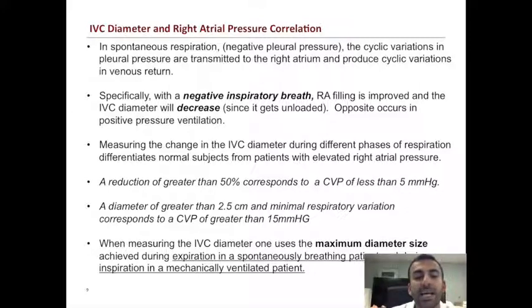Very important to realize that when you're measuring the IVC diameter, you need to use the maximum diameter size achieved during expiration in a spontaneously breathing patient and during inspiration in a mechanically ventilated patient.